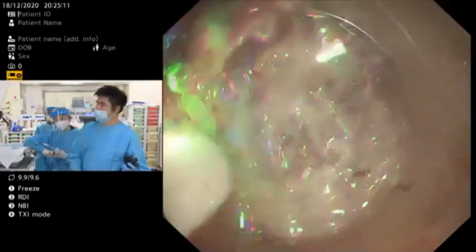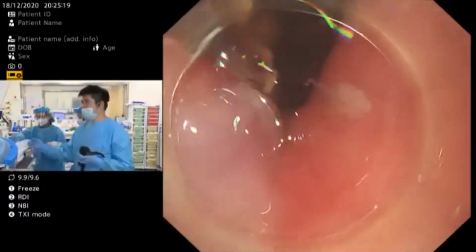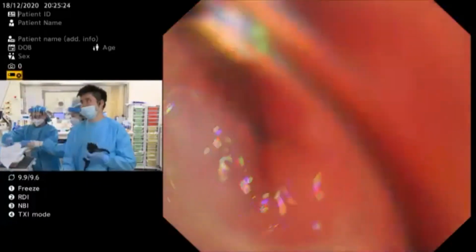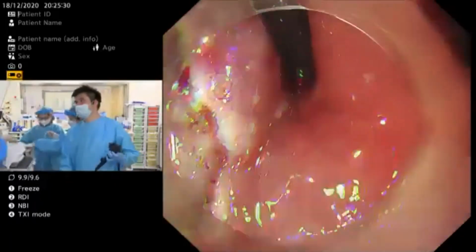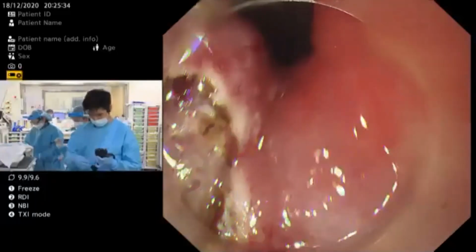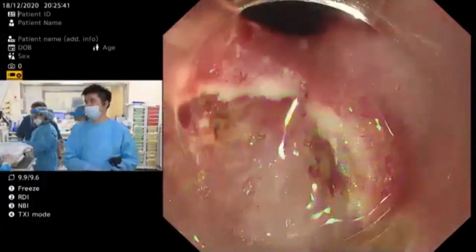So far, no fibrosis from the previous. I think no, but maybe in the proximal, I'm not sure, because the scar is at the proximal. So I'll clean the knife because it seems a bit dirty, and I'll add some injection so that I can get a better submucosal plane injection. So perhaps I can add a bit more for this side, and in the two lateral sides as well.